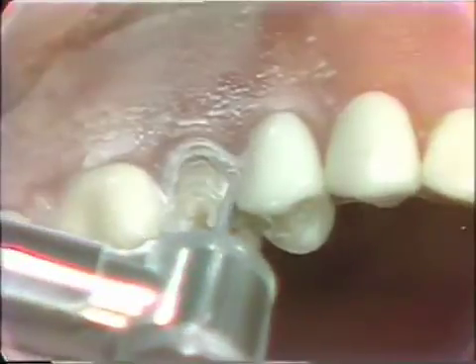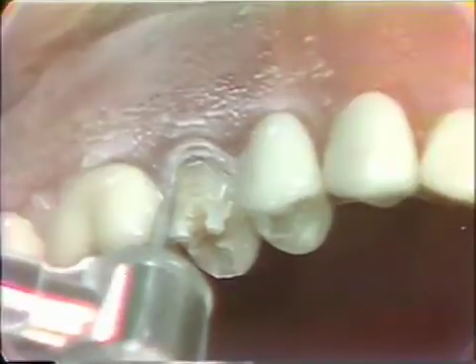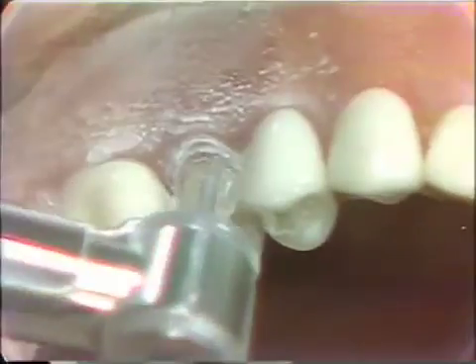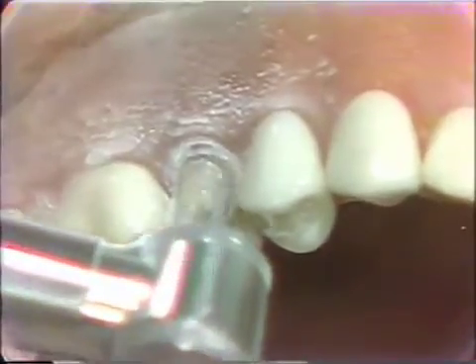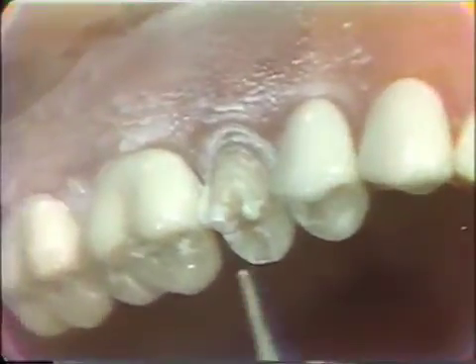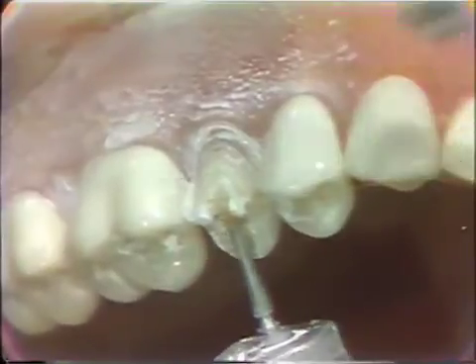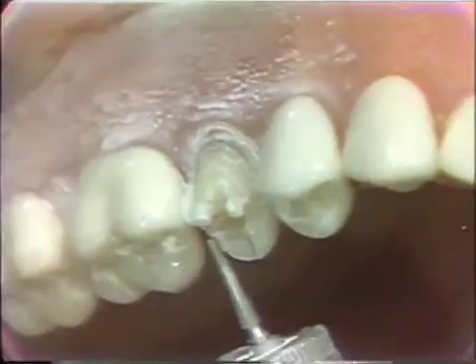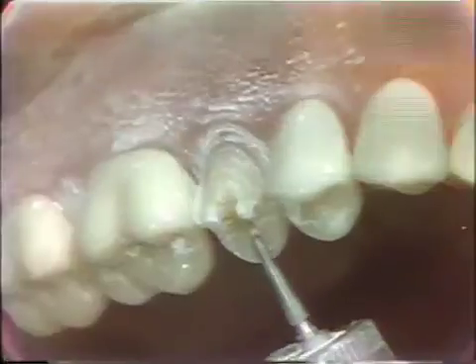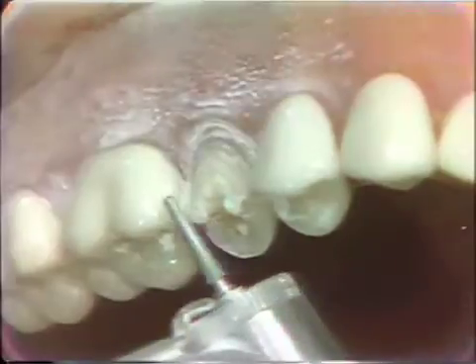With the same diamond you can go a little farther in, again taking care not to disturb the adjacent tooth. Then coming in from the lingual, we can reduce the occlusal surface, again using the same diamond, reducing the occlusal surface from this axis.